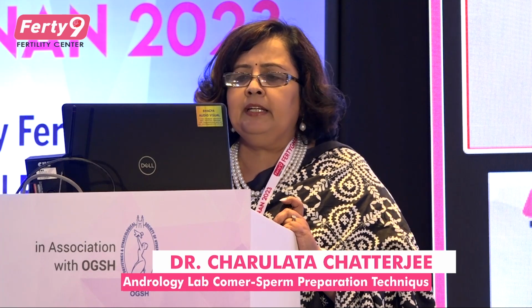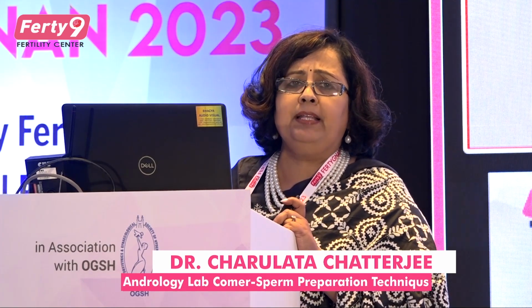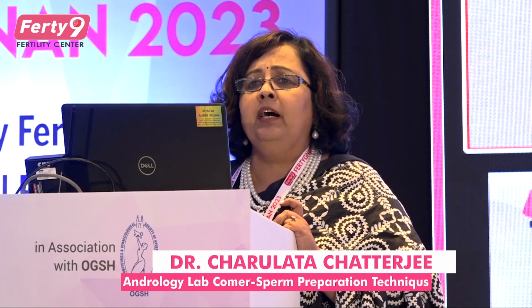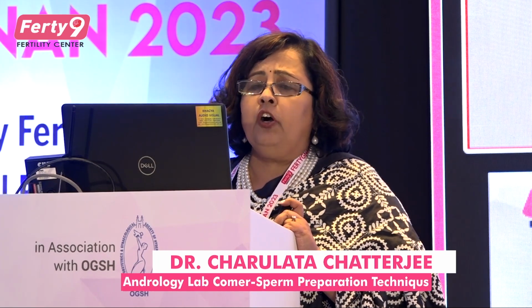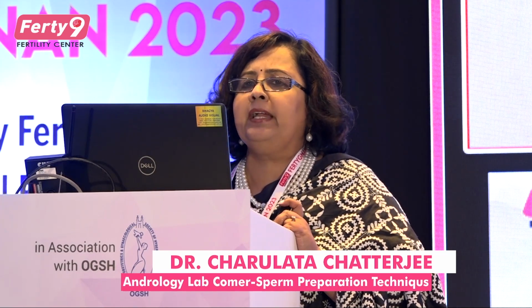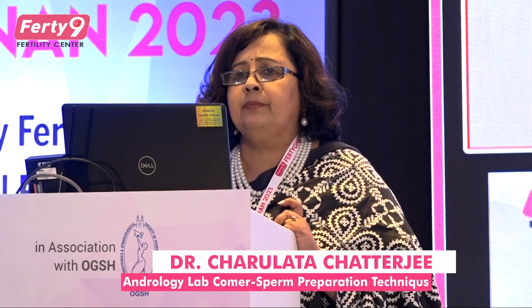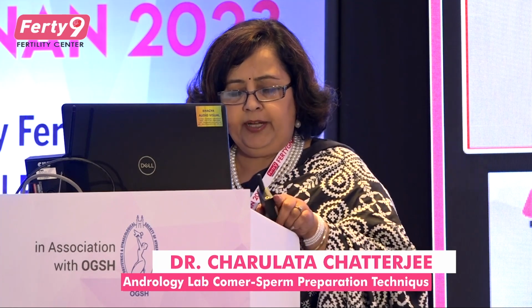The take-home message is that a number of preparation methods are available, but we should see whether the sample is oligozoospermia, normozoospermia or oligoasthenoteratozoospermia. Based on the semen analysis, we should choose the semen preparation technique in the lab, and if the sperm DNA fragmentation is borderline, we should choose between MACS and microfluidics, which can be useful as advanced sperm preparation techniques. That's about my talk. Thank you.